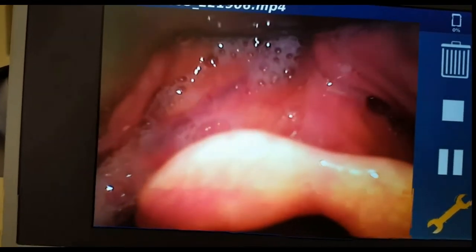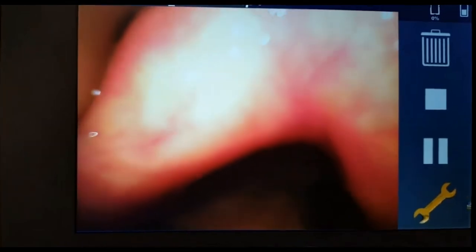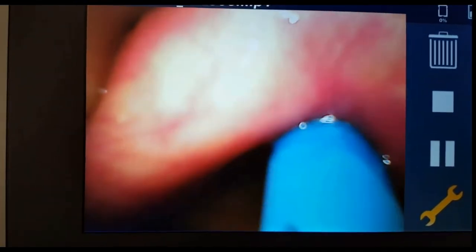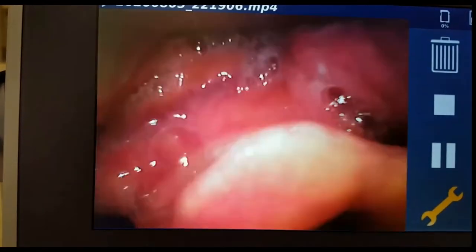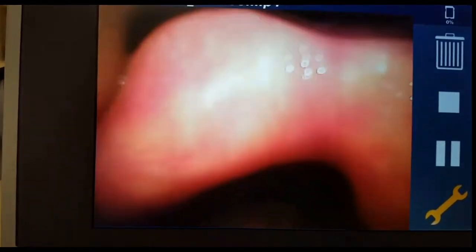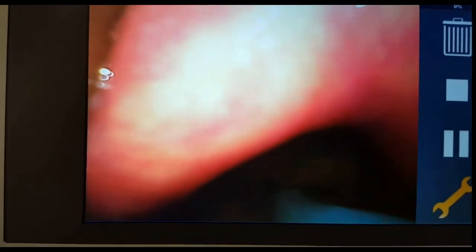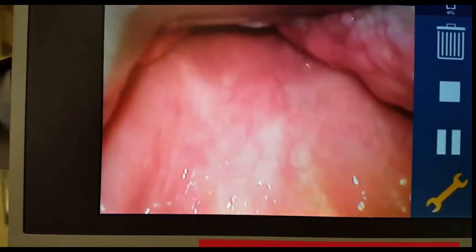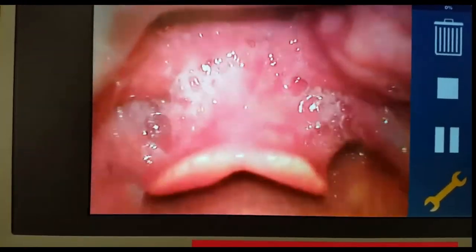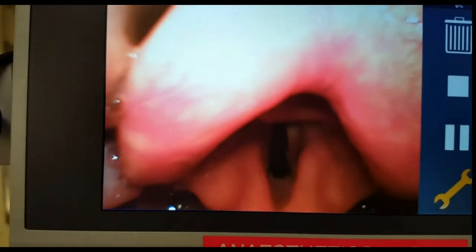As you can see, the tip of the video laryngoscope is actually to the left of midline, so the epiglottis did not lift up that much. We tried to pass the bougie but because the vocal cord view was not clear enough, I gradually withdrew the video laryngoscope and am now reinserting it.